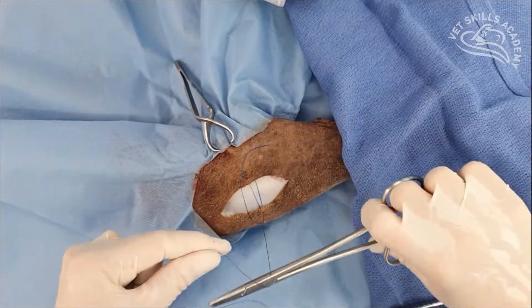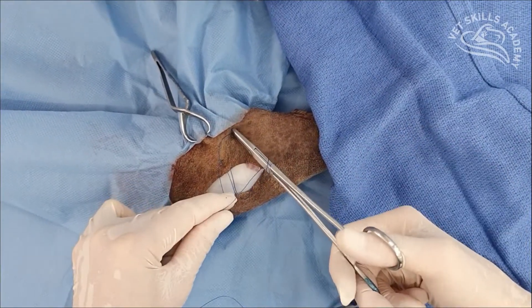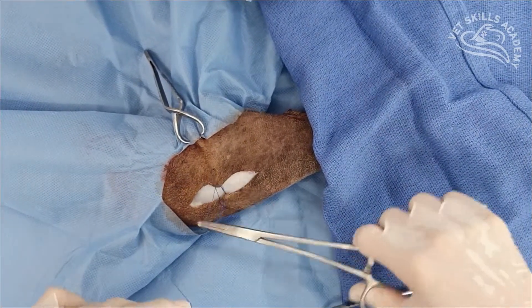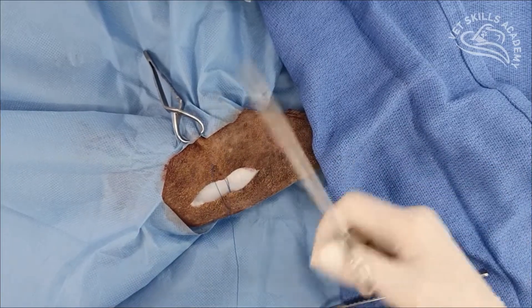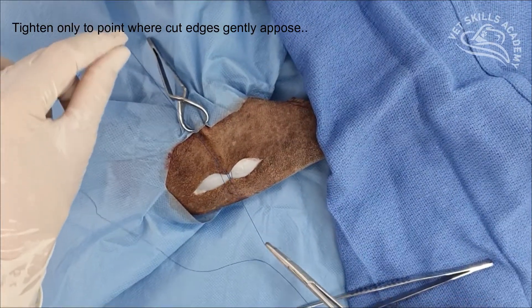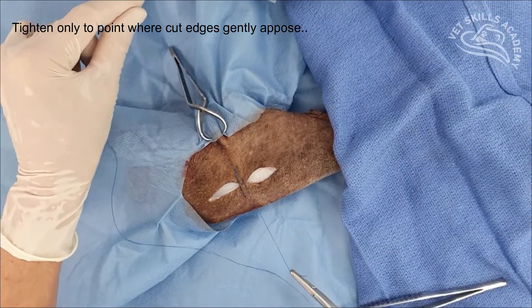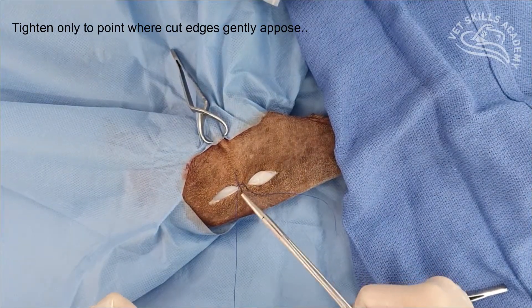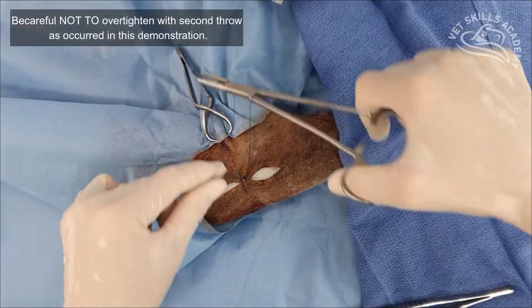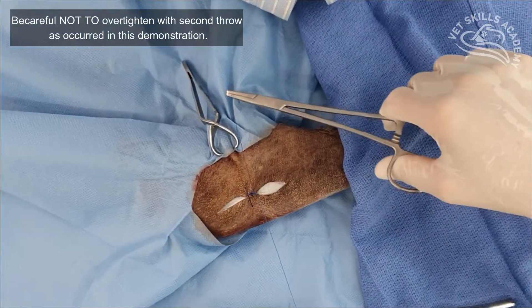Okay, so now we will tighten it up. You can either use a slip knot or a double throw surgeon's throw here. As we tighten this up, I need to have both my short end and my long end on the same side. As we tighten up, the two near components will allow for apposition of the skin edges. The two far components of the bite help take tension off this cut edge. We then finish off the knot, and it's always nice to set that knot just slightly to one side of the cut incision, so as it oozes any serum, we don't clog up the knot.